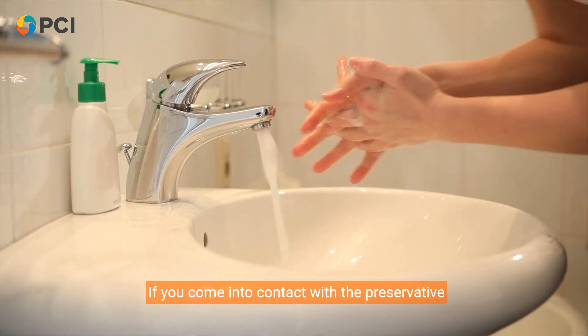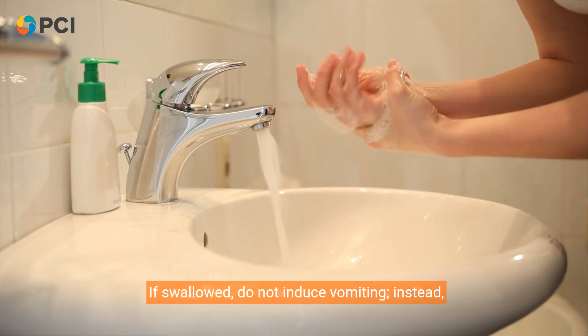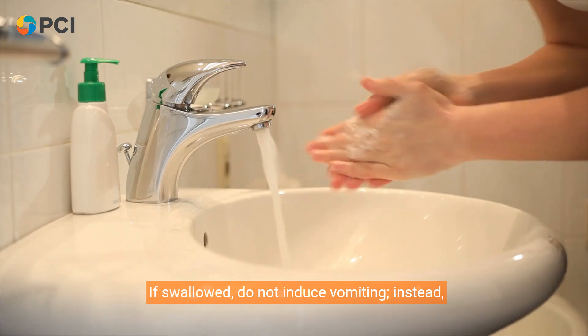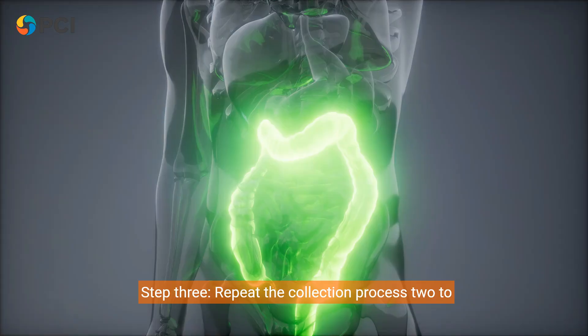If you come into contact with the preservative liquid, wash the area with water for 15 minutes. If swallowed, do not induce vomiting. Instead, drink plenty of water and seek medical attention immediately.